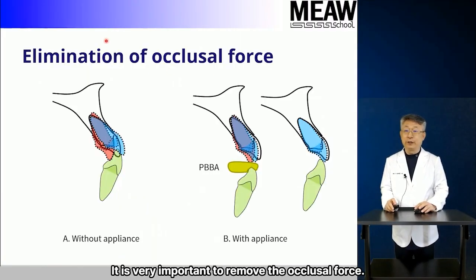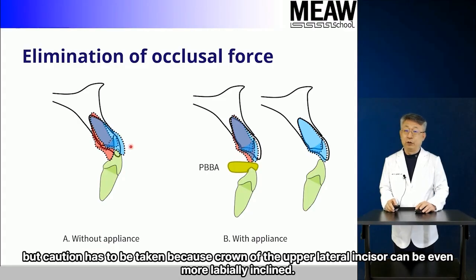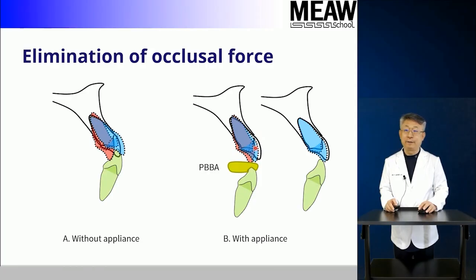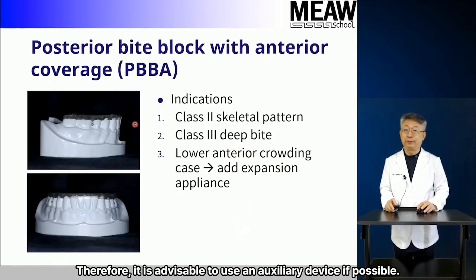It is very important to remove the occlusal force. The tooth can still move without removing the occlusal force, but caution has to be taken because the crown of the upper lateral incisor can be even more labially inclined. On the other hand, if PBBA is used, the mandible rotates backward and downwards, so the upper lateral incisor can be jumped out with little movement. Therefore, it is advisable to use an auxiliary device if possible.